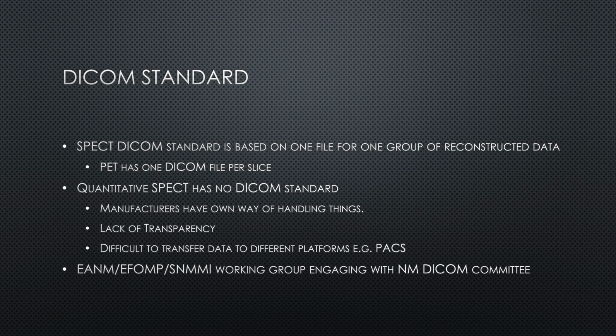And then if you have your quantitative SPECT data, it might work quite well on your manufacturer's viewing station, but as soon as you transfer to PACS, things don't work. Fortunately, people are trying to engage with the DICOM committee on this. There's a new group being formed by EANM, EFOMP and SNMMI to engage with the Nuclear Medicine DICOM committee.